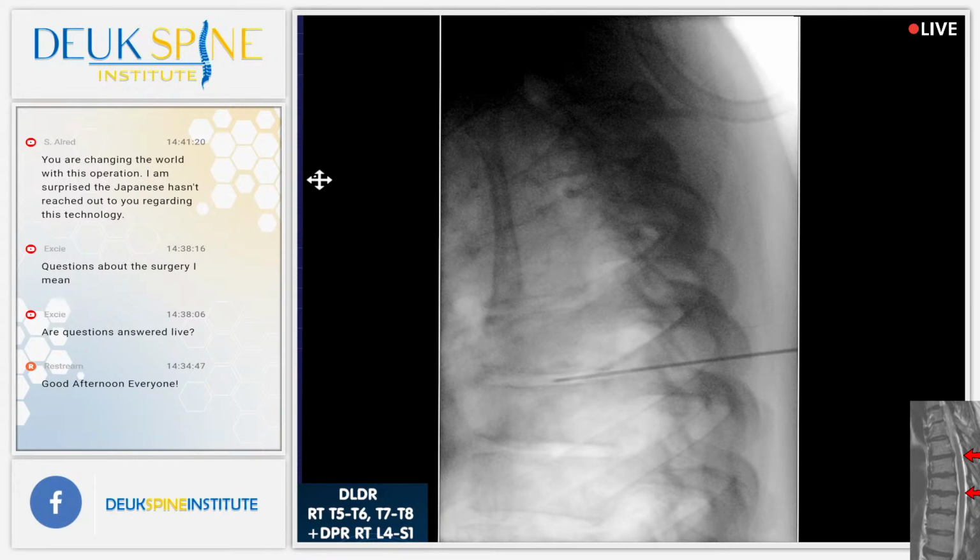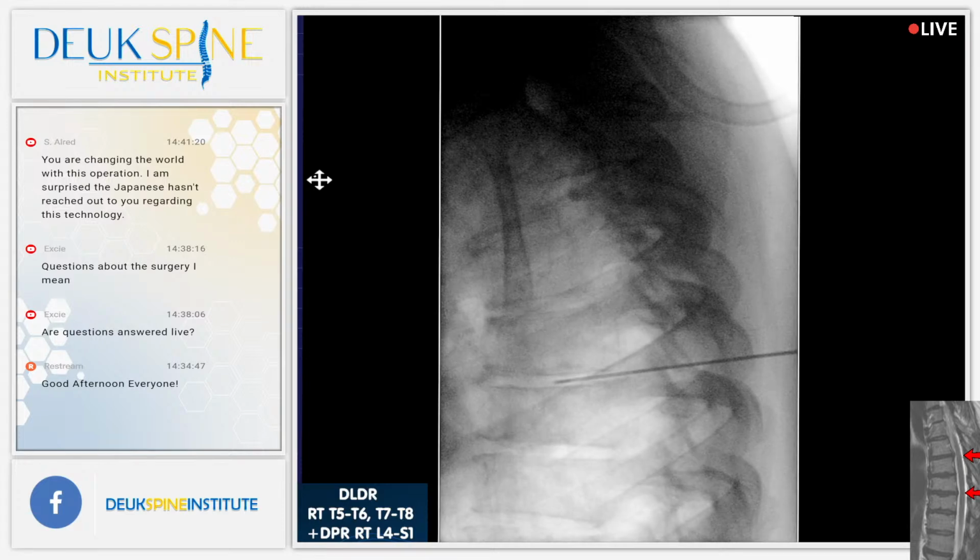So everyone agree that's 7, 8? I think that's 7, 8 based on my counting from up, down, and down, up. The next one is 5, 6. So we're going to skip a disc, right? And we're going to do 5, 6. I'm going to give you a little more numbing medicine, okay? Don't be upset. That's just the numbing medicine going in.